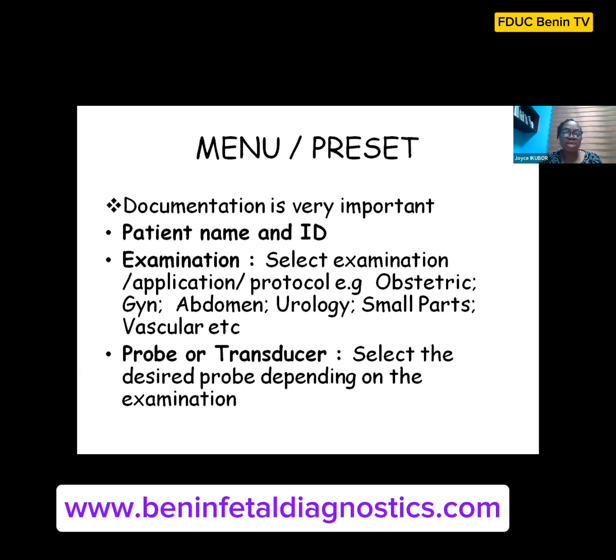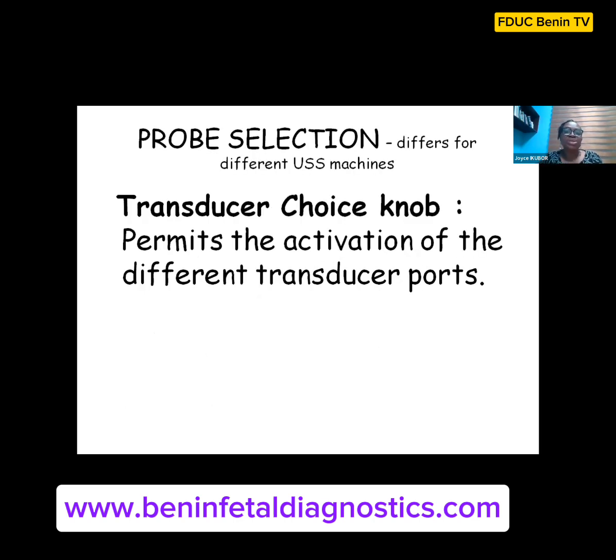All this is also on the machine, especially if you have a machine that different people are using. Like in my department, the radiology department, we have the ultrasound machine being used for the examination of different parts of the body. So for each examination, you have to select the desired probe for that examination.